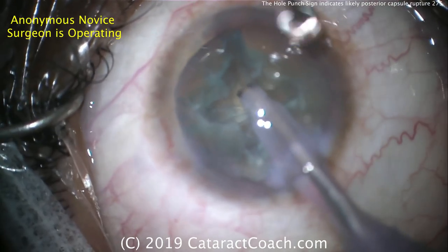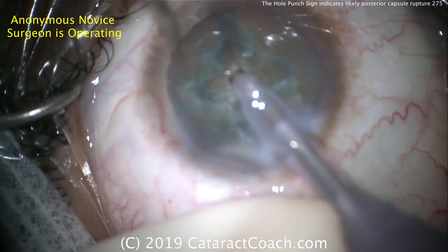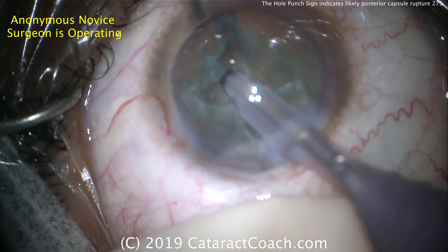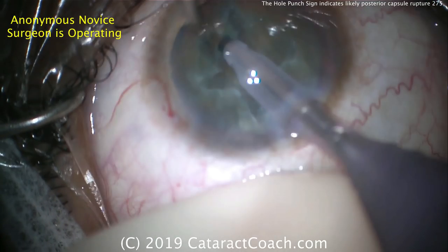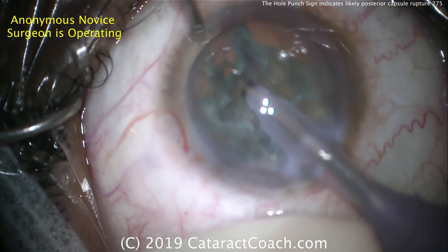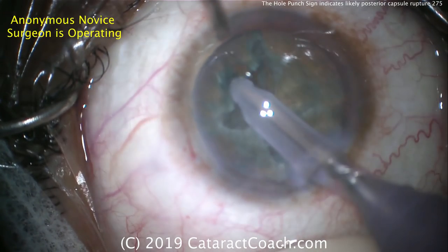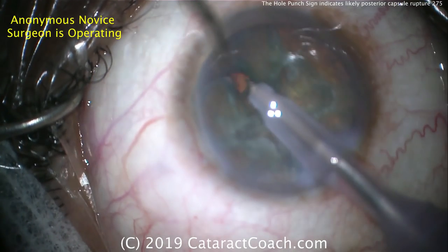At this point, the surgeon should rotate more and try to fully separate. But instead — watch carefully — I'm going to try to bring a piece out of the capsule bag with high vacuum. And that's the issue right there. You just saw it. This quadrant's not fully separated, and so attempting to use high vacuum and some phaco power holds the piece.